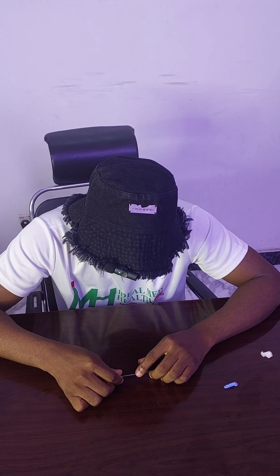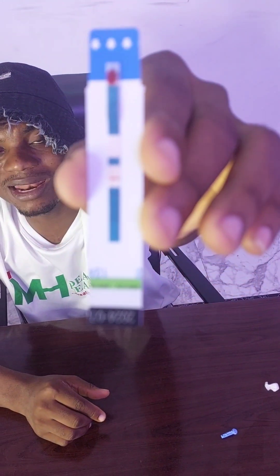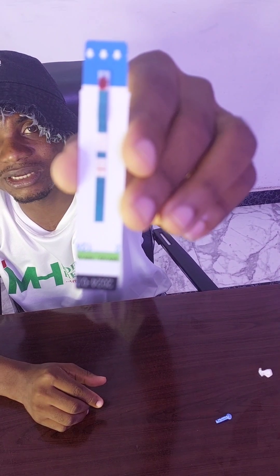We have waited 20 minutes — I know you want to see my results. Negative! From this you can see just one line on the control segment, which means I'm negative. I advise checking your status every three months depending on your level of exposure. This is one of the simplest ways you can check your status from the comfort of your home.